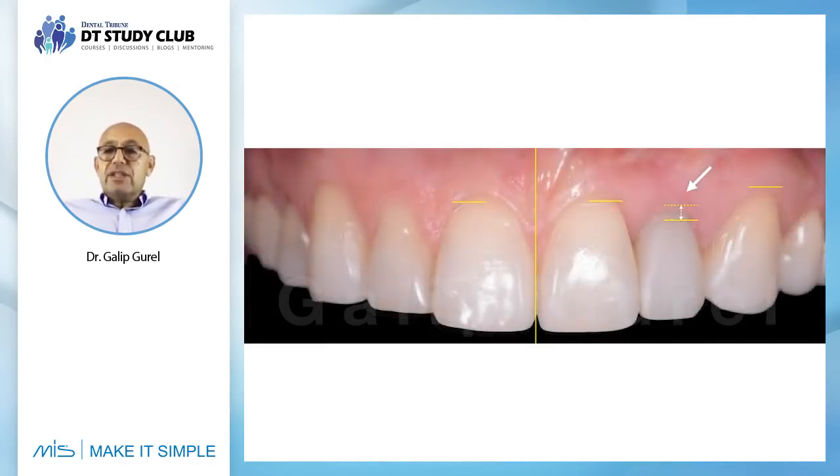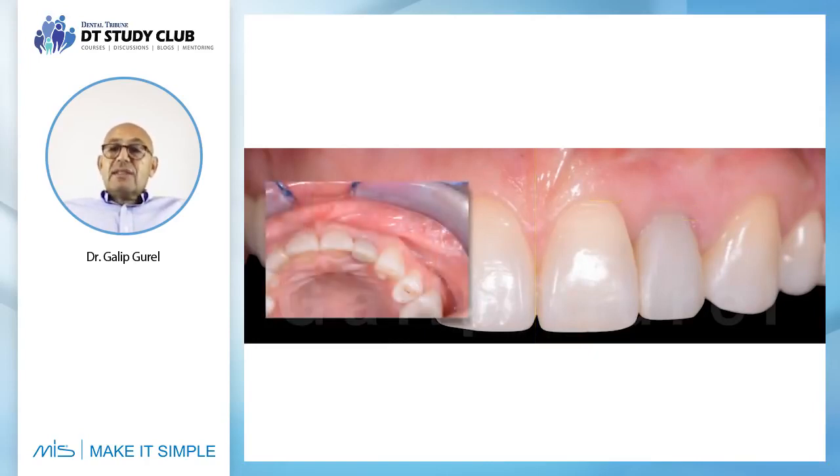When it comes to my provision, well, we're just treating this patient, so we stopped here because we need to just replace this with a porcelain crown. It's gonna be peanuts.